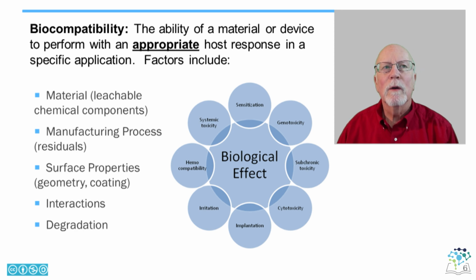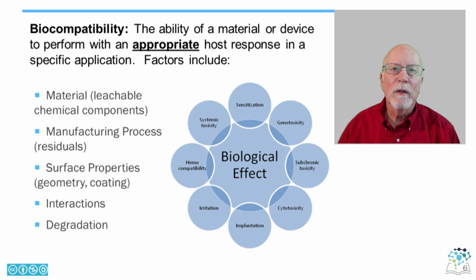In general, the factors influencing biocompatibility include the following: the material from which the device is manufactured, the manufacturing process, including any additives, lubricants, or release agents, which may be integral parts of the build, surface properties such as specific geometry or coatings, interactions between these materials of composition, and finally changes in the device due to the effects of the biological system or tissue, such as biodegradation, or any subsequent chemical change of the device over the duration of its implantation or use.